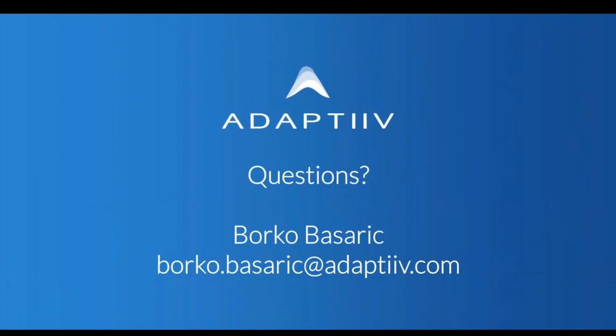Well, thank you very much, Borko. That was quite the presentation. Really got in depth there, and really insightful work that you and the team here at Adaptiiv have done with respect to the hotspot correction and the MEB module overall. So really great work. Thanks for sharing the background that went into this really amazing research. And yeah, we are open for questions, as you mentioned.